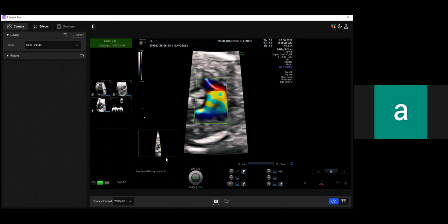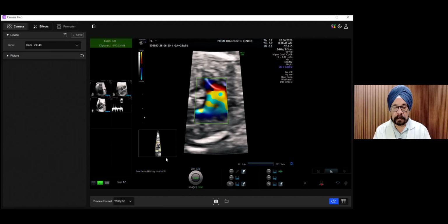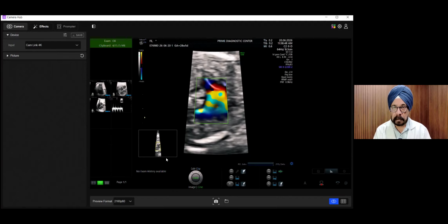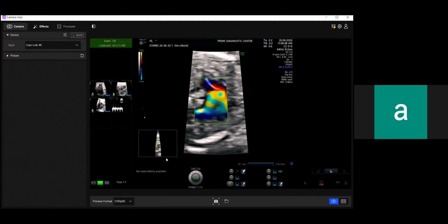Thank you, sir. And the extended views and all the views you do in a fetal echo? I generally don't do extended views. It's going to be a bit challenging, but I'll do it for you. Okay, sir. And I'll tell you the tricks how to get an aortic arch and how to get a pulmonary arch. Thank you, sir.